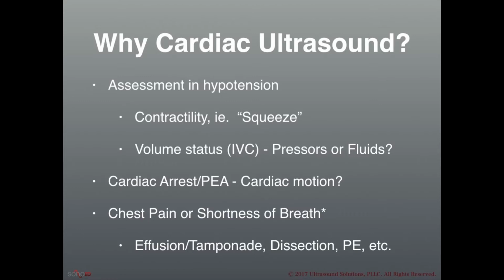Lastly, we'll use it to augment our workup of patients with chest pain or shortness of breath. I put an asterisk by this because a lot of these diagnoses that we consider in patients with chest pain or shortness of breath, point of care ultrasound may be rather specific for, but it tends to be not always the most sensitive test for some of these conditions.